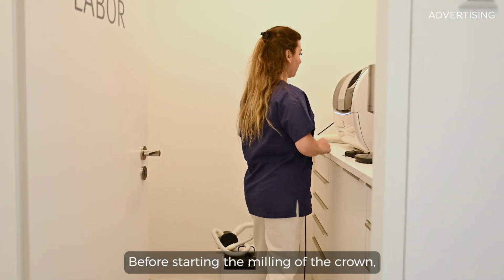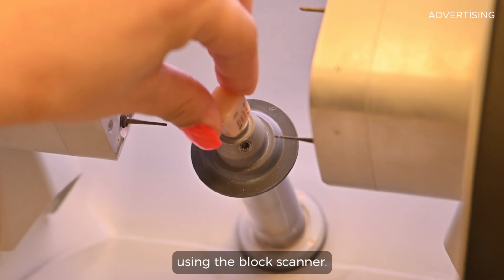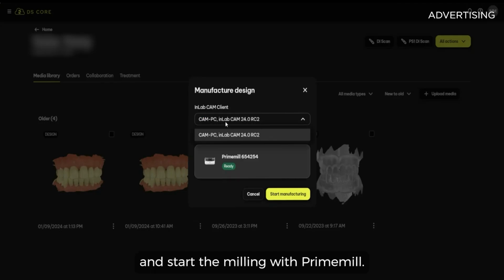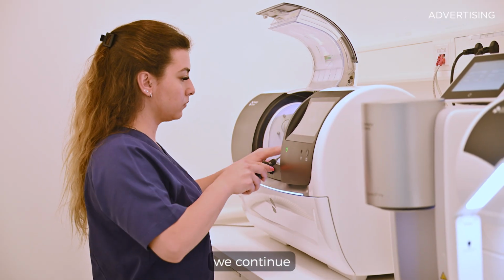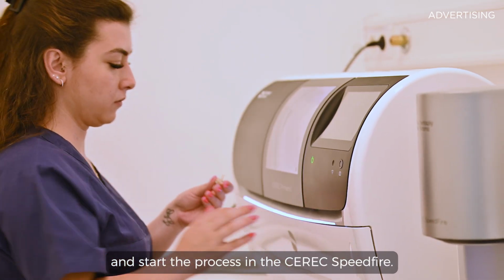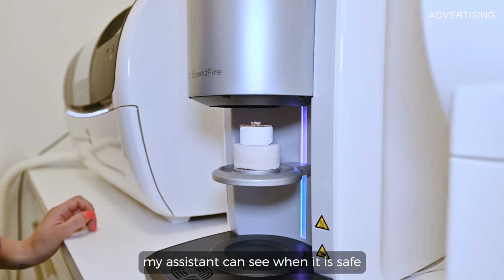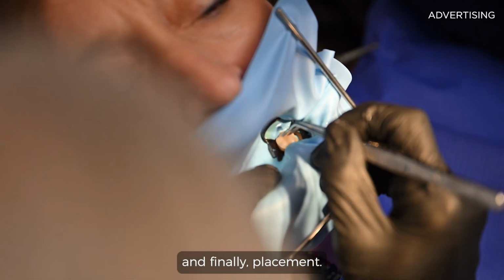Before starting the milling of the crown, my assistant inserts the right block into the CEREC Primemill using the block scanner. Now she can open the design file in DS Core on the tablet and start the milling with Primemill. When the milling process is completed, we continue with removing the restoration from the block and start the process in the CEREC SpeedFire. Thanks to recent updates of the CEREC SpeedFire, my assistant can see when it is safe to move the restoration for further processing and, finally, placement.